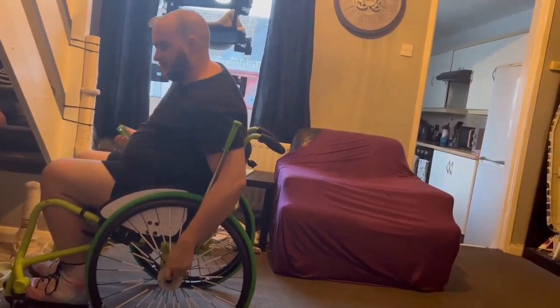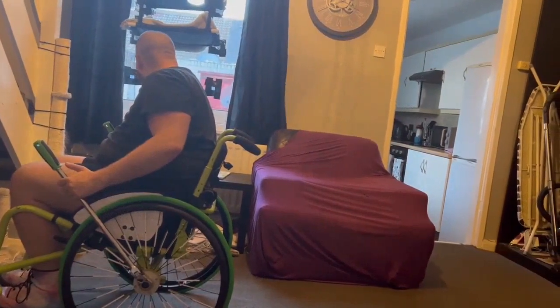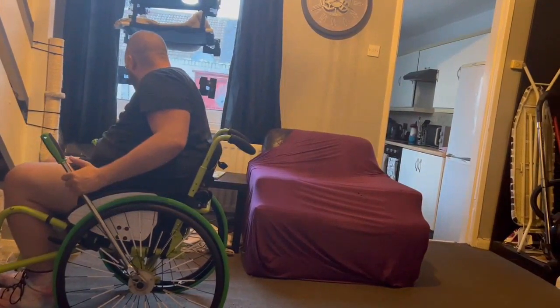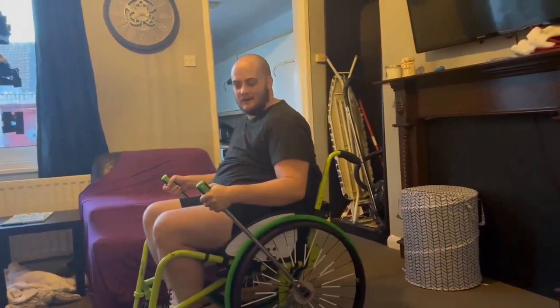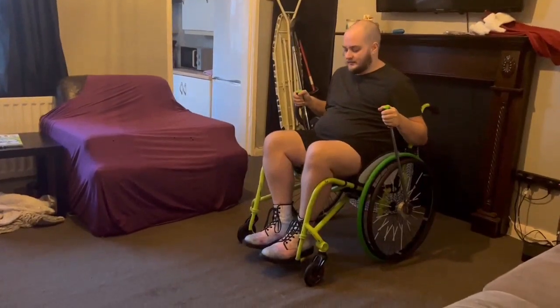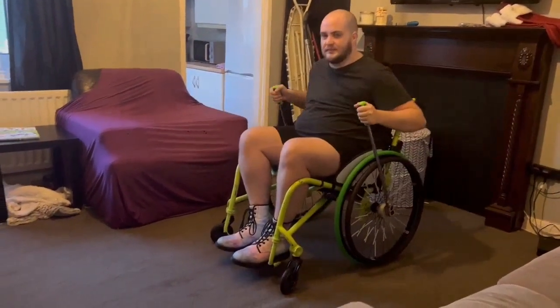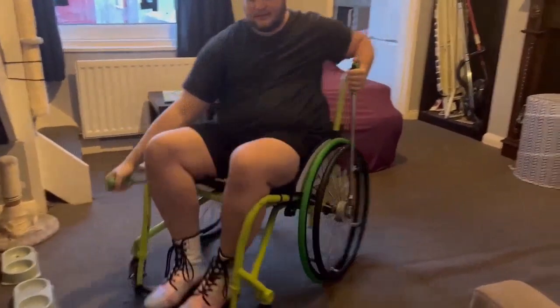If you need to back up, you just switch the direction. That's how it works. So to pop a curb, you can still do that with these — just pop the wheelie, just like in a regular chair.